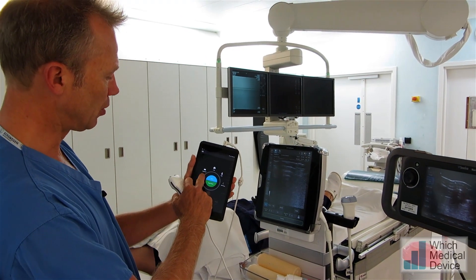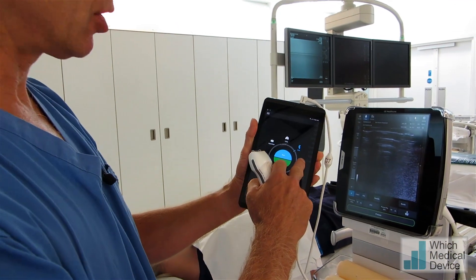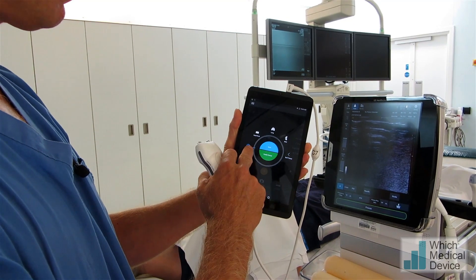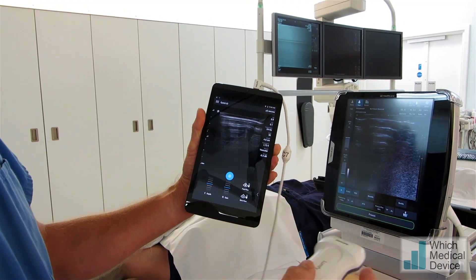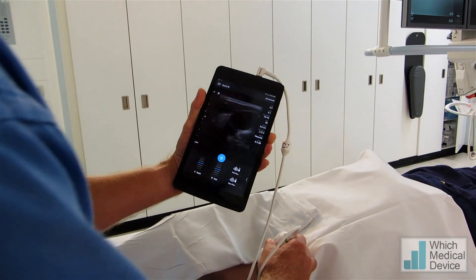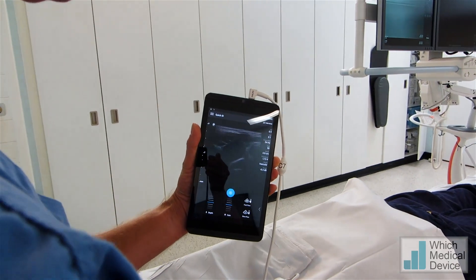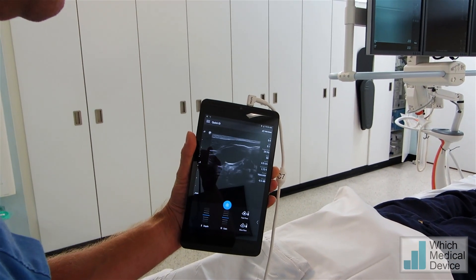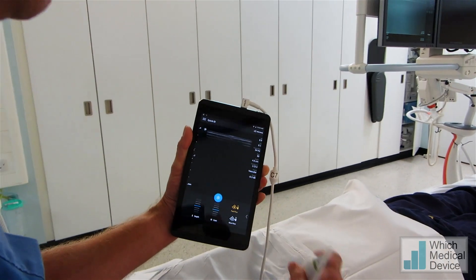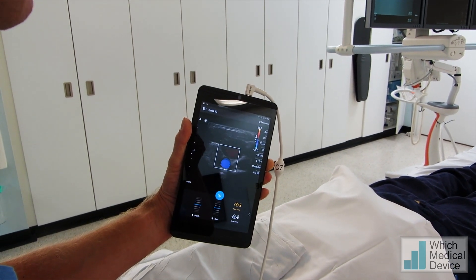First of all, you can see that we can switch between vascular, superficial, lung, MSK and soft tissue settings. We'll just go to a vascular setting, click scan, and we'll just start scanning. We're just going to scan the jugular and you can see you actually get a very nice image there. We can go to Doppler — if we go to fast flow, good Doppler.